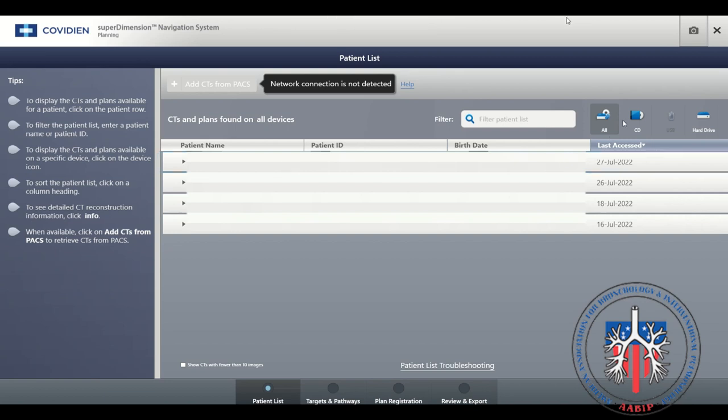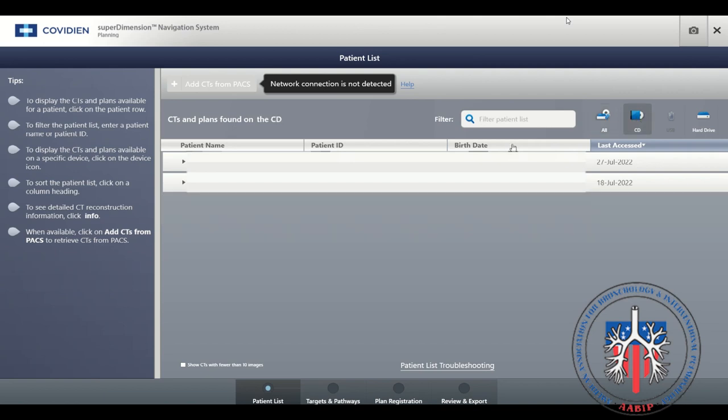If using a CD, select the CD icon to see your patient's images. Then select your patient.